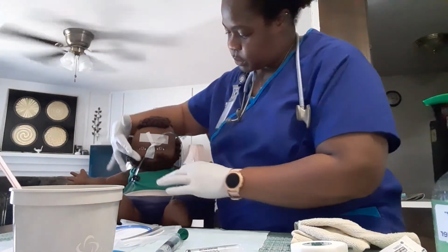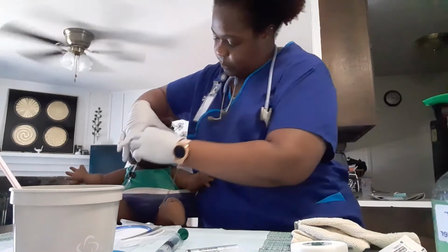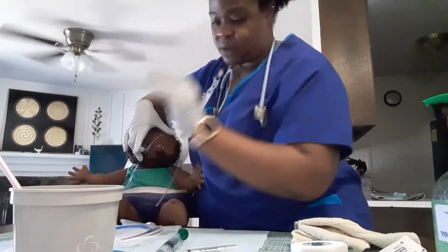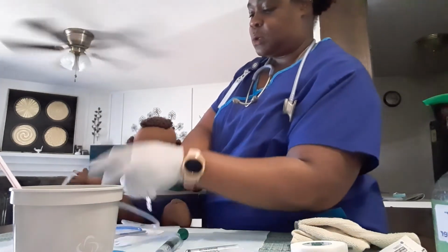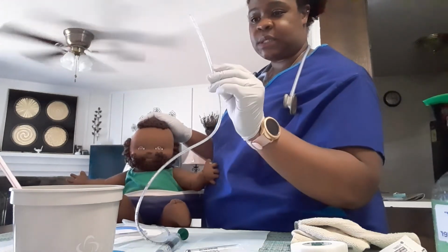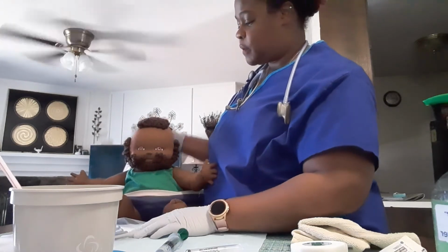So the first thing I'm going to do is hold the tubing and remove my tape from the patient, and remove the fastener that is fastened to the gown. I'm going to have the patient take a deep breath in, hold their breath, and I'm going to pull the tubing out. I've pulled the tubing out. I'm going to assess the tubing. The tubing is intact. I am going to document my findings to the provider.